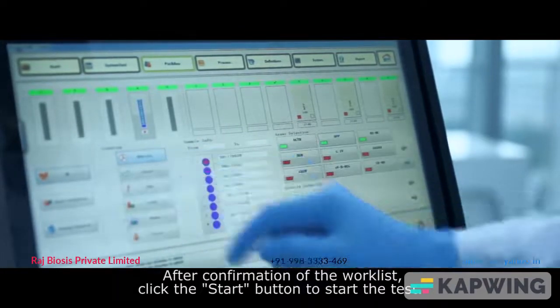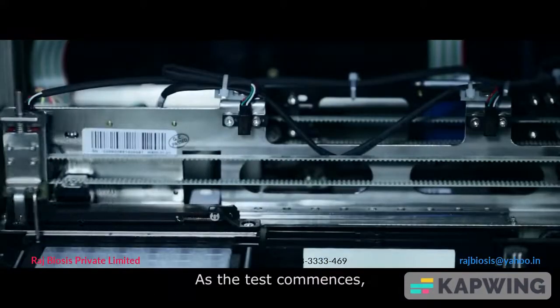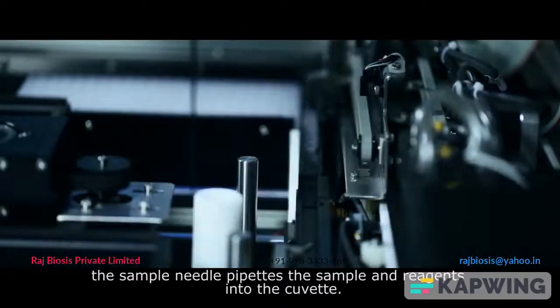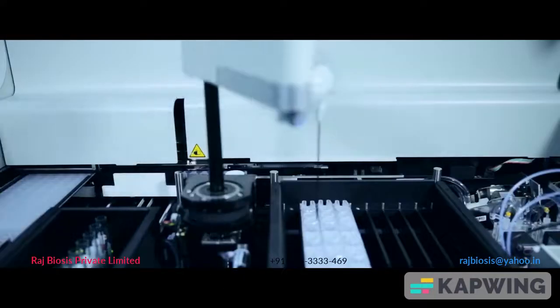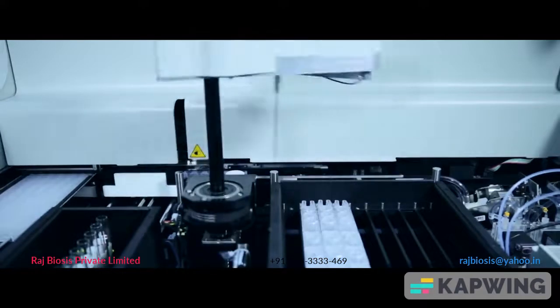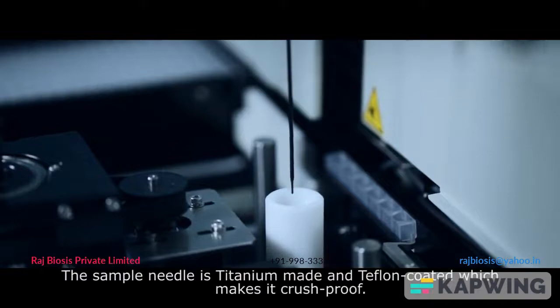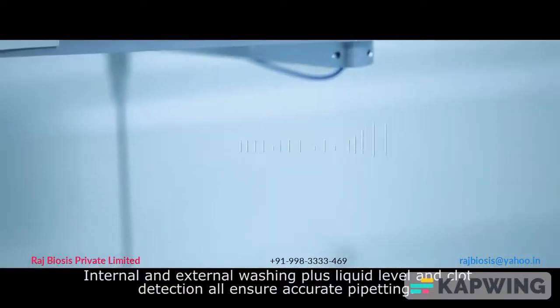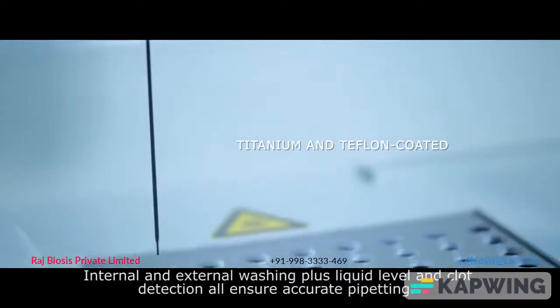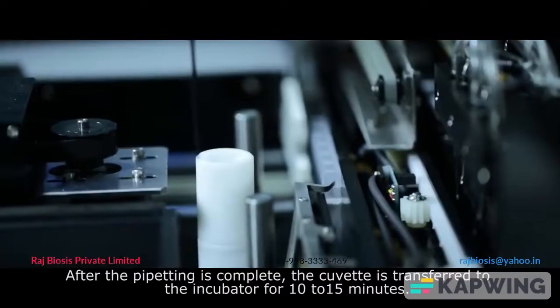After confirmation of the work list, click the Start button to begin the test. As the test commences, the sample needle pipettes the sample and reagents into the cuvette. The sample needle is titanium-made and Teflon-coated, making it crush-proof. Internal and external washing, plus liquid level and clot detection, all ensure accurate pipetting.